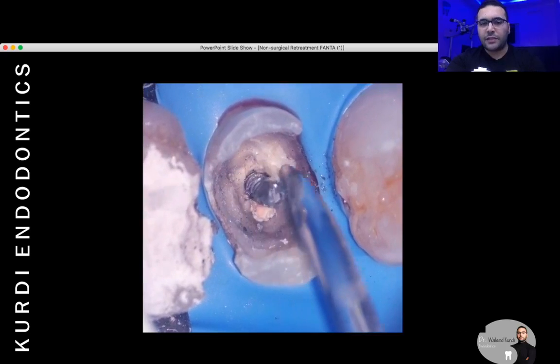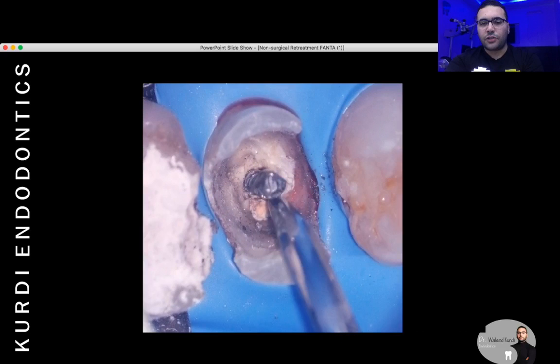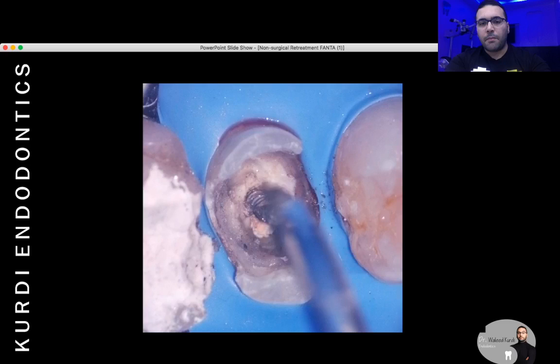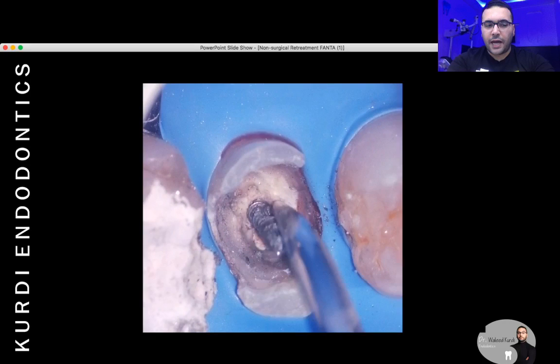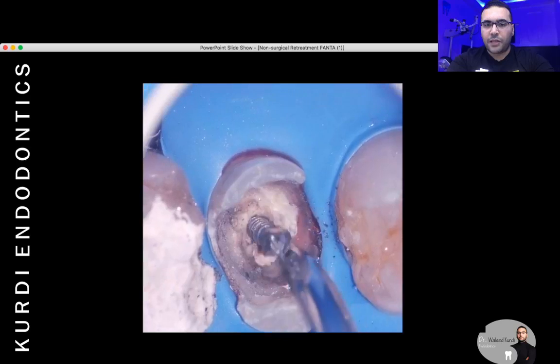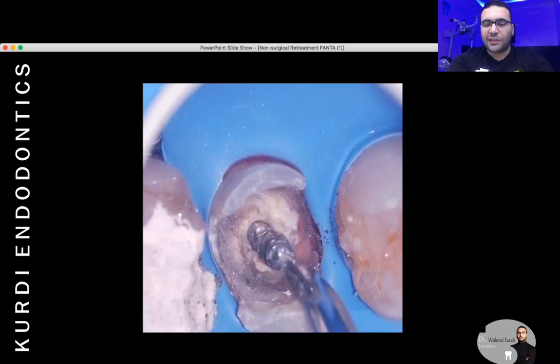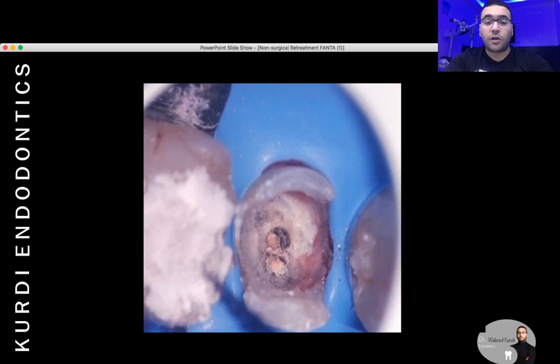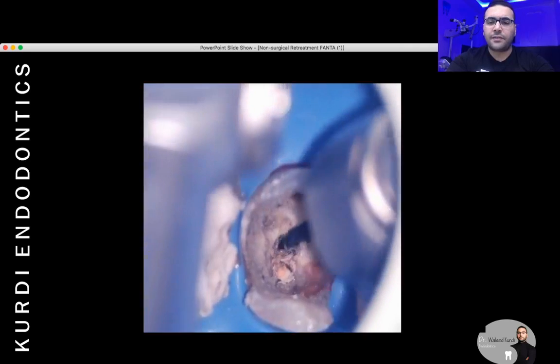And here with this ultrasonic tip, you are trying to remove this post from inside the canal, but in a way, I don't know why you didn't grasp it easily and remove it. Why are you using ultrasonic? We are going to talk about all of that.